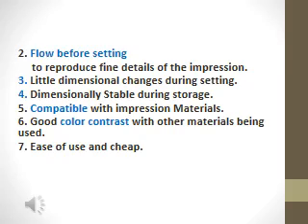Okay. Number 5, compatibility with impression materials. All gypsum products, or model and die materials that we use, should be compatible with impression materials. What does it mean, compatible with impression materials? It means that they will not interact with each other.